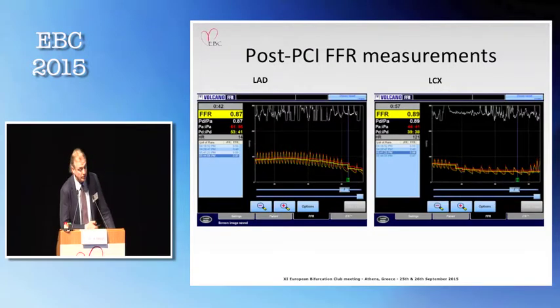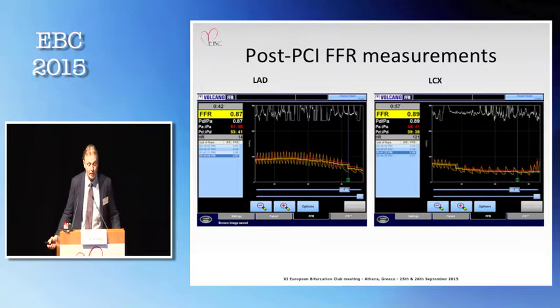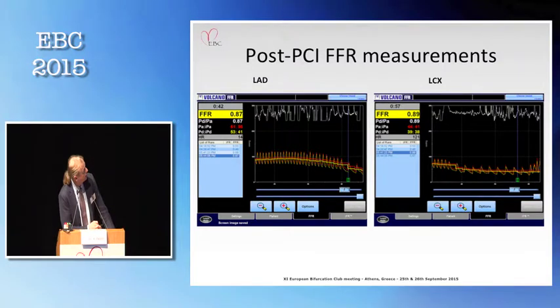And afterwards, as you see here, the FFR is 0.87, 0.89, and that's what we did in both vessels.